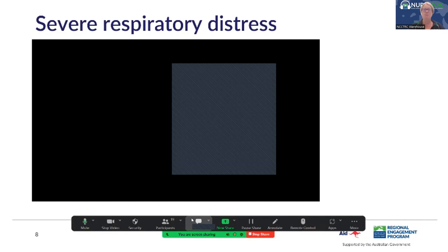start within 2 to 3 minutes. Fantastic. That's really good. And in Port Vila, less than 3 minutes. Excellent. So if you have a high flow machine that's set up ready to go with all of the tubings, it can be really quick to set up.